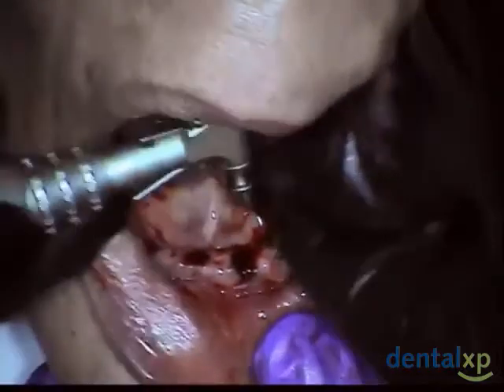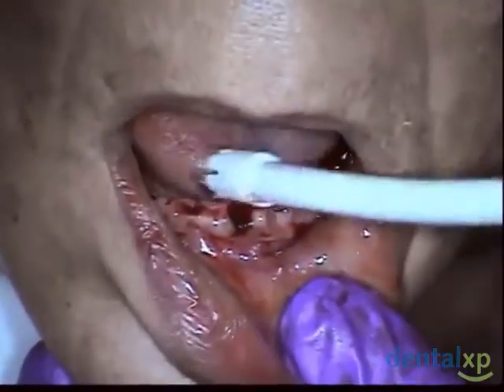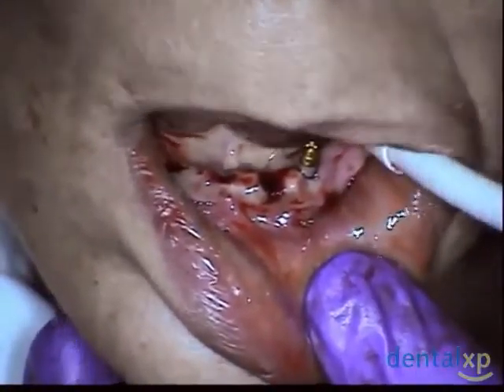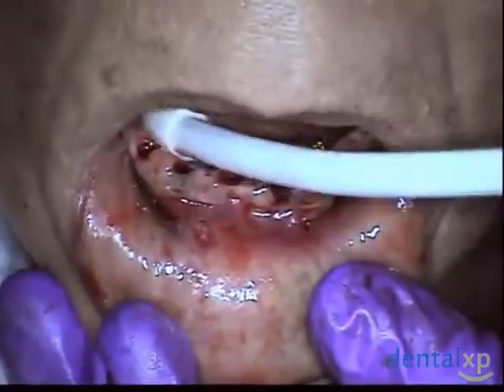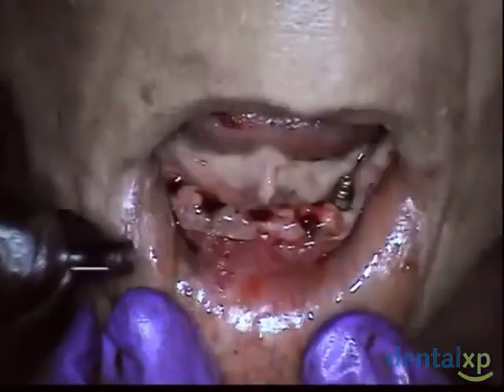Okay, now there's where we are. You can see we're not close to being seated yet, but we're within about 2 millimeters of being completely seated. So I'm going to go and use my wrench with the handpiece. I can't feel what I'm doing with the handpiece. With this, I can feel the bone expanding, for instance. I can feel that if it's getting to a point that I may want to bring it back out and use something else.